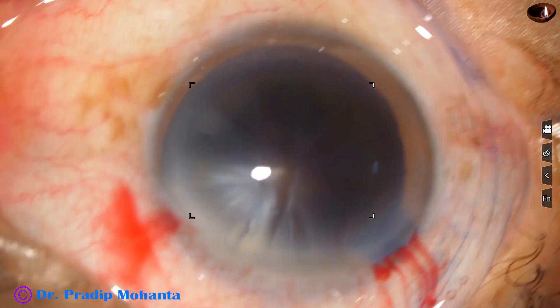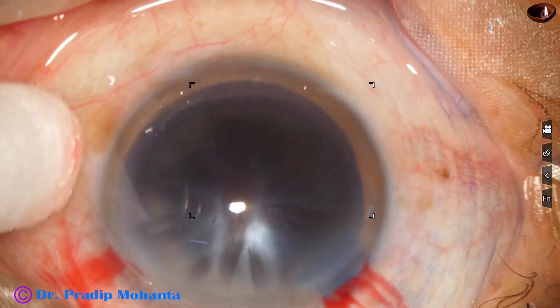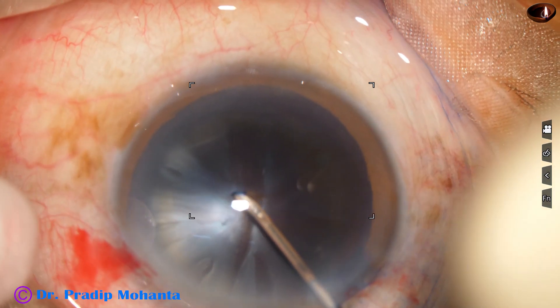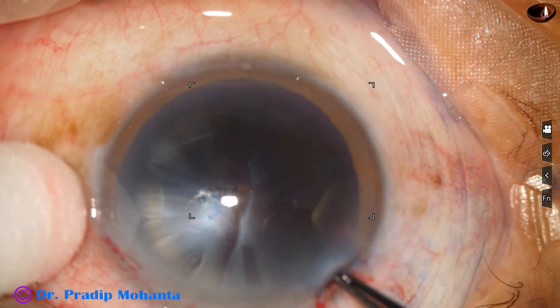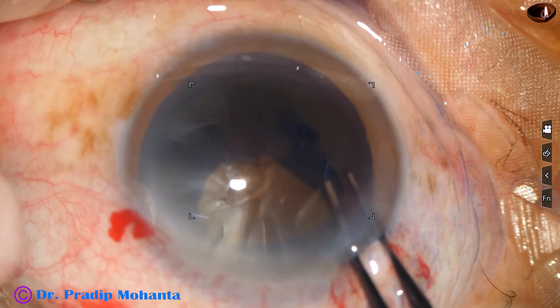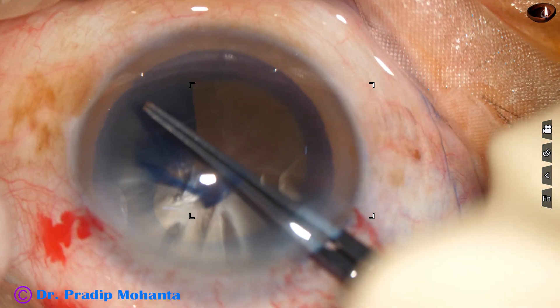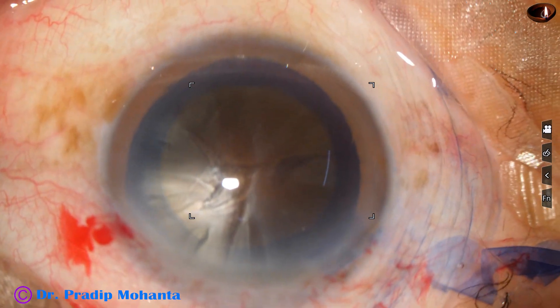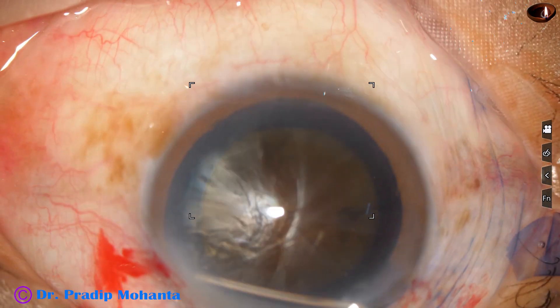Anterior rhexis: I am going to incise the anterior capsule with a needle — a 26-gauge bent needle cystitome. Now I use a Utrata forceps, hold this capsular tag, and do a big rhexis. The size of this rhexis is about 5.75 to 6 millimeters.